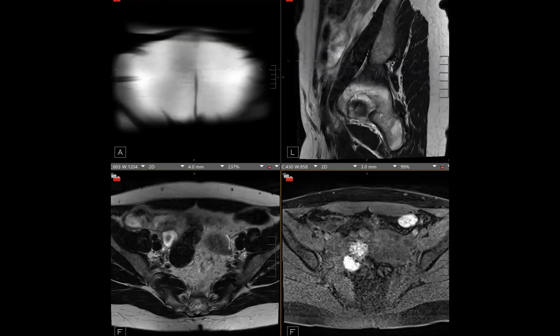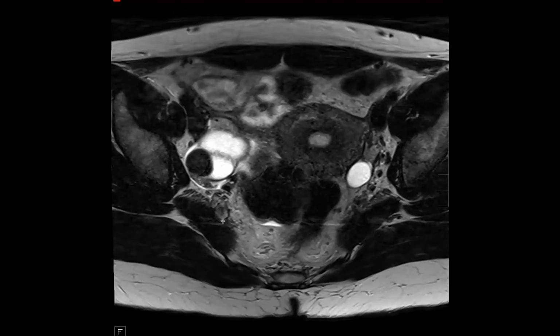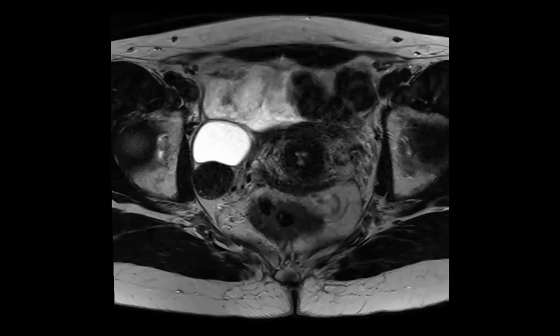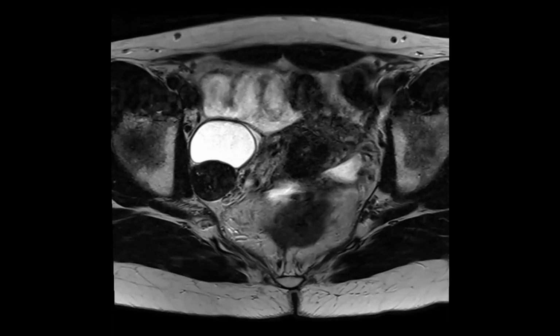There was an ovarian mass seen on ultrasound, and we got an MR. I think this is a good resident case. Maybe a senior resident, if we have any. I'll take it. Residents, do you guys want to speak up?